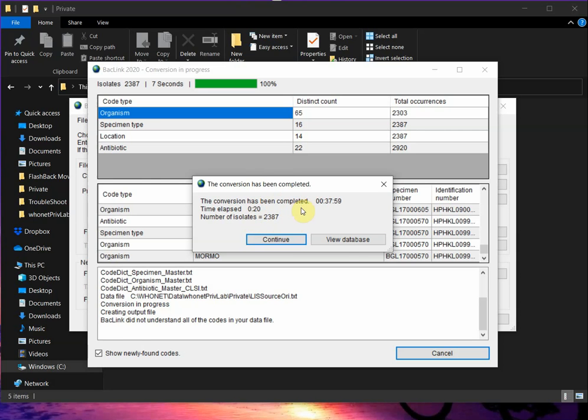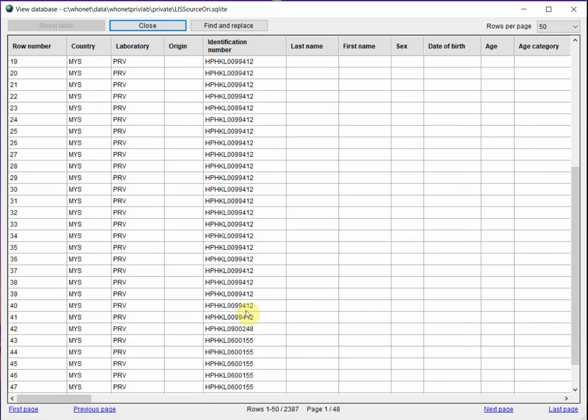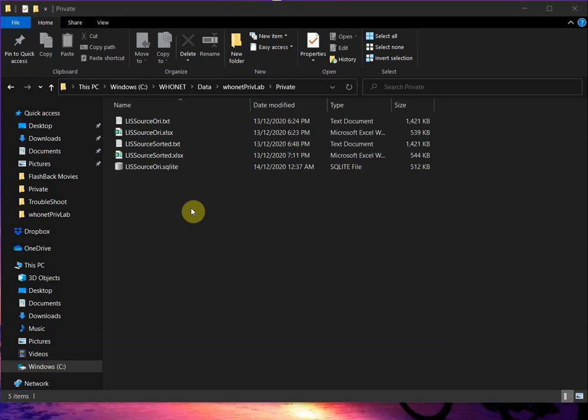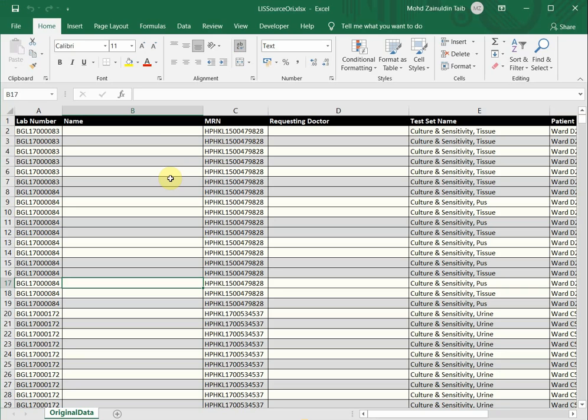Something went wrong. When we view the database, you can see under this ID, there's a mix of swab and tissue. Organisms also are not sorted. We get more than what was expected. Now this is the data source in Excel. How many isolates should we have from the source data file? I've shown in the previous video clips 3 methods to know how many isolates there should be. Anyway, I'm going to use one of the methods.